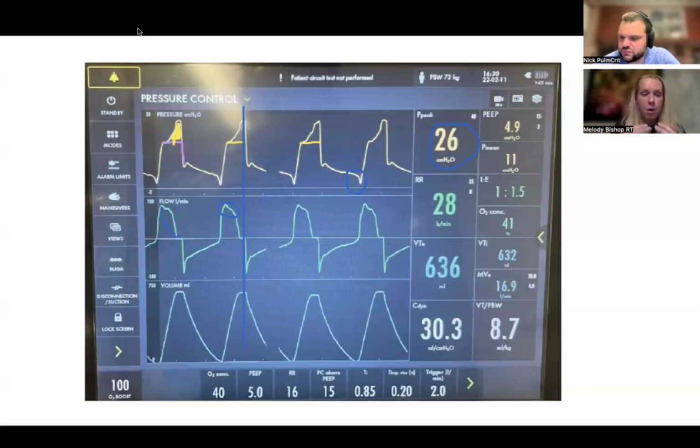And I'd remind people that when it comes to modes of ventilation, if you don't have all the fancy tools like esophageal probes, NAVA, or PAV, pressure support is the mode where the least number of variables is controlled by the settings, and the patient has a bit more power, even if it is just cycling. That in itself can sometimes get you out of your own way when it comes to these dyssynchronies, and help you figure out how to match your patient if you can't just leave them in pressure support.